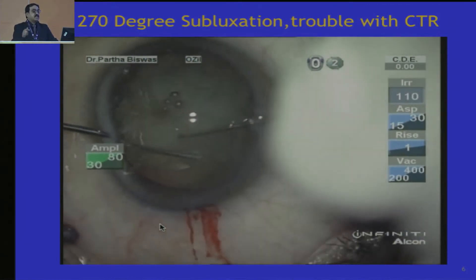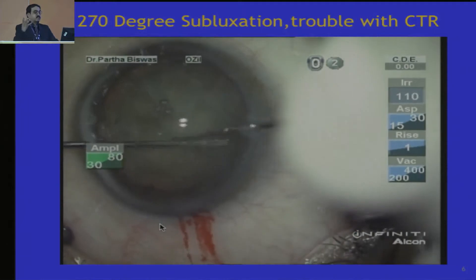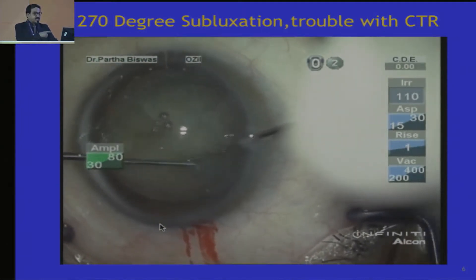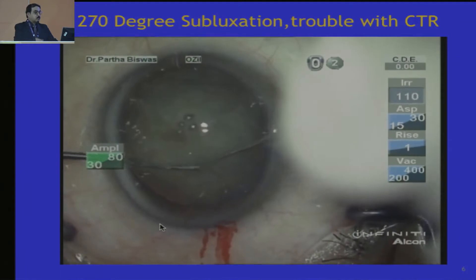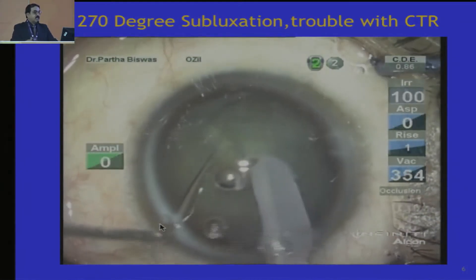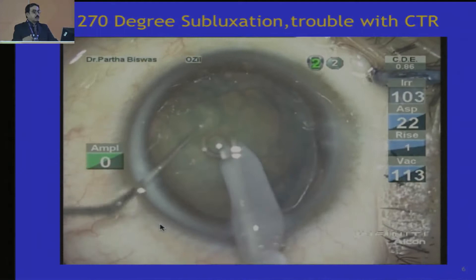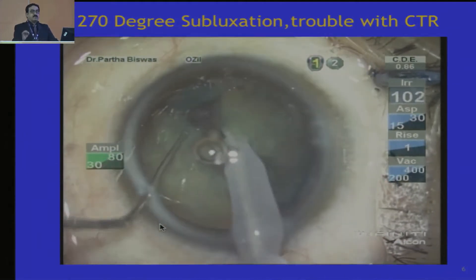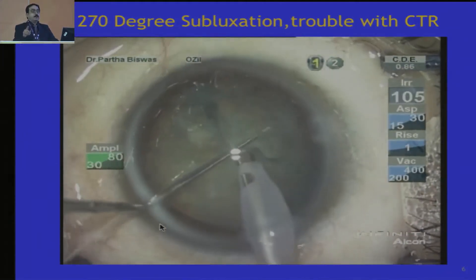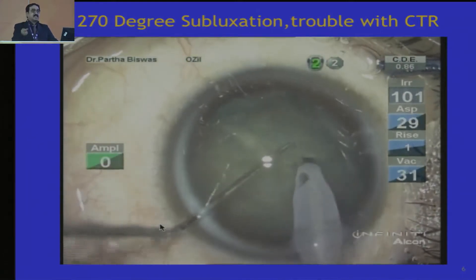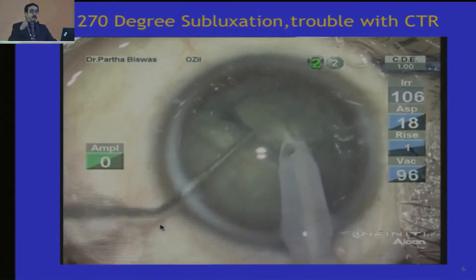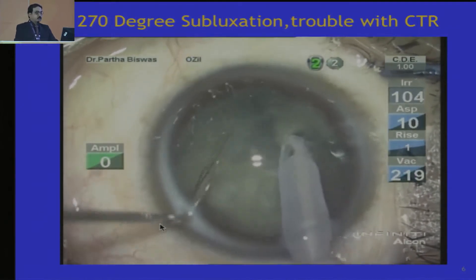With large subluxations, you do not have the support of the zonules and the bag to place in all these devices and you are trying to wiggle it in. So it has gone in this time quite well. You have to be 100% sure — especially with a well dilated pupil — that the CTR has actually gone into the bag and one end has not slipped out into the angle.